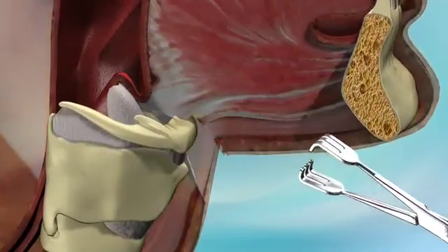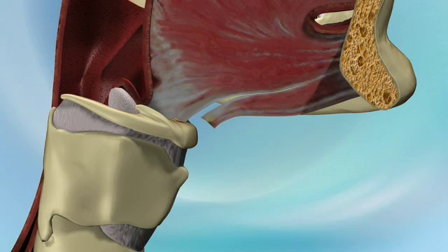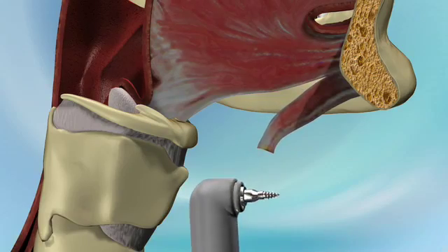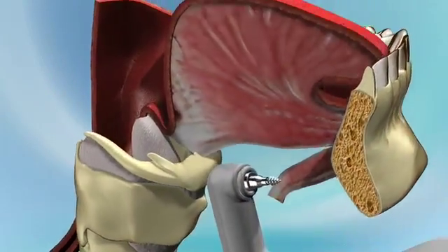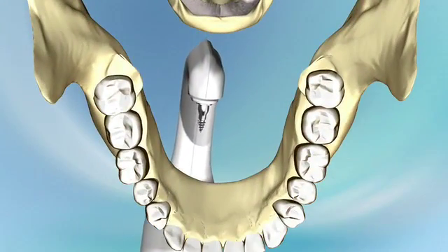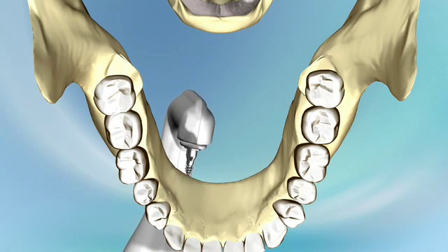The clamp is removed. Subplatysmal dissection tracts are made to the posterior aspect of the mandible at the level of the lower canine teeth. Using a Repose bone screw inserter, the first Repose bone screw is implanted into the posterior mandible, approximately 1 to 1.5 centimeters up from the inferior rim at the level of the lower canine teeth.